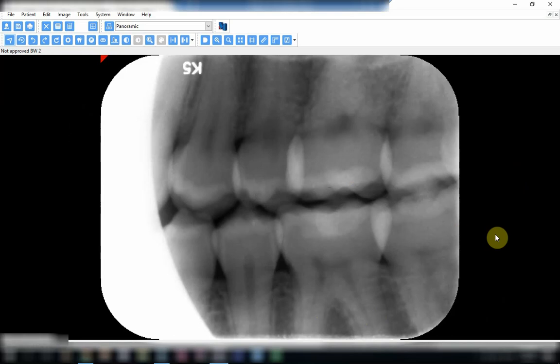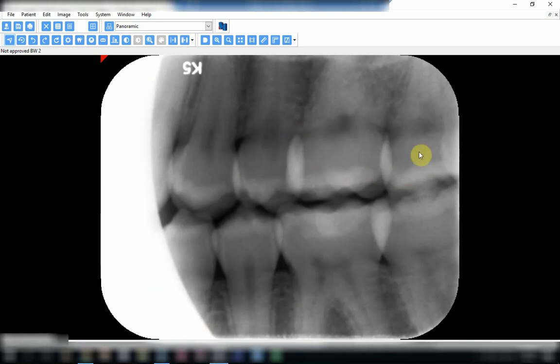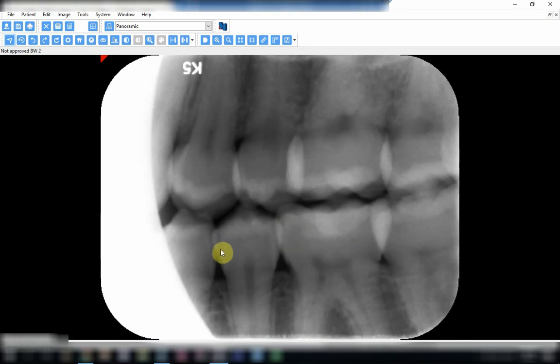Another bitewing of this patient repeats the same problems: cone cutting and overlapping margins. The cone cutting resulted from incomplete coverage of the sensor. The margins overlap one over the other. The purpose of a bitewing radiograph is to see the entire proximal areas of teeth and the level of the alveolar bone, so if there are overlapping margins we will not be able to see the contact points.